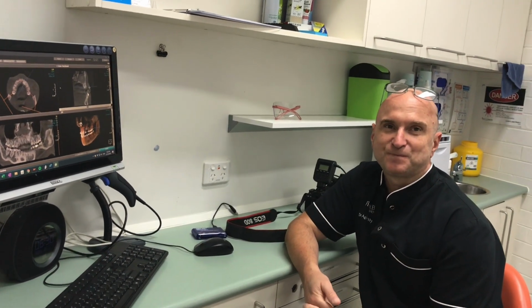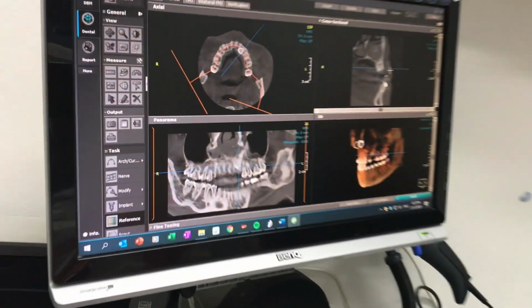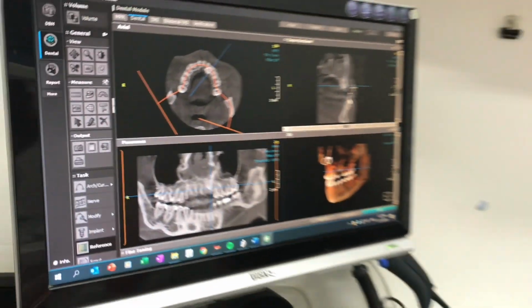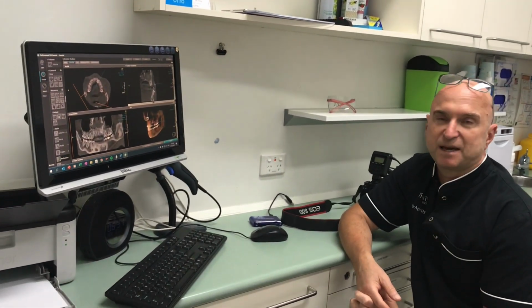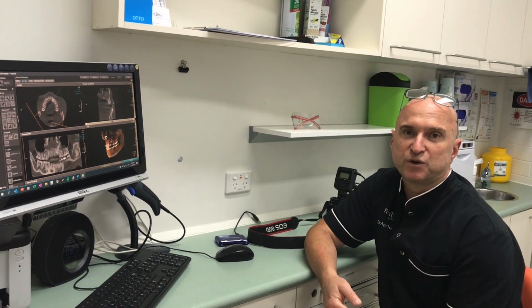Sure, given obviously having that preparation at the outset before you even approach the surgical site, in your mind you already know the path that you're actually going to take. So it's a lot easier to see with 3D, would you agree? Exactly. And you cause less damage, you cause less problems, and the patient's aware of what you're going to do as well.